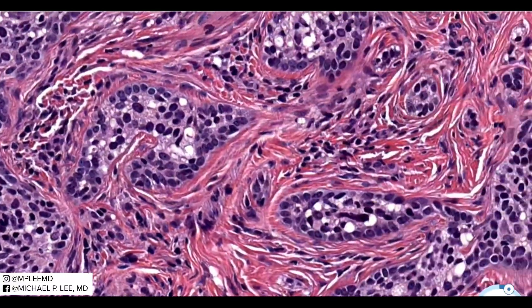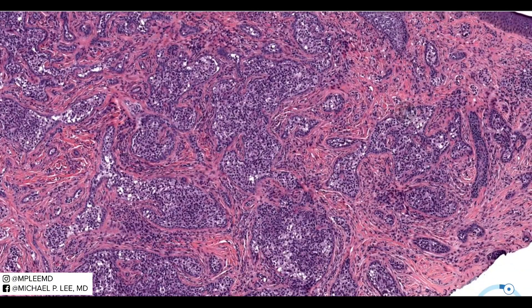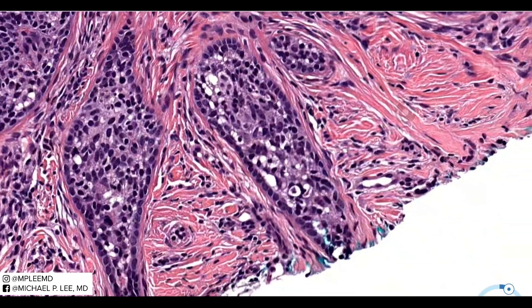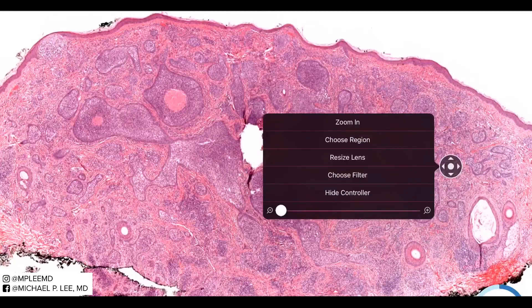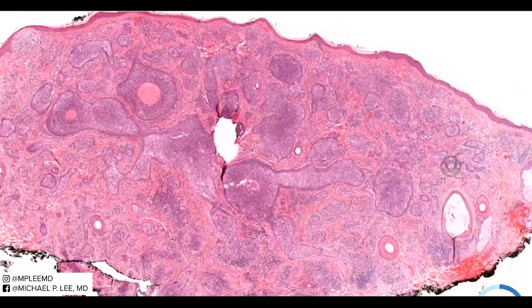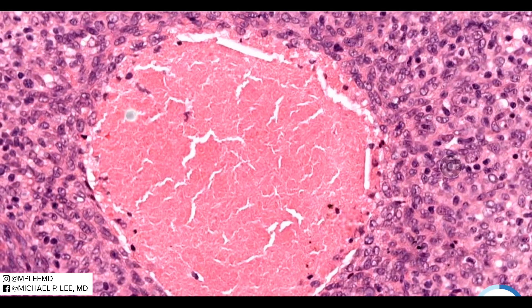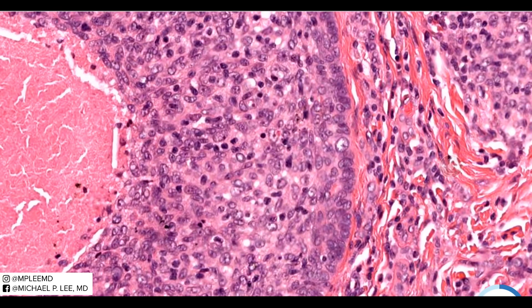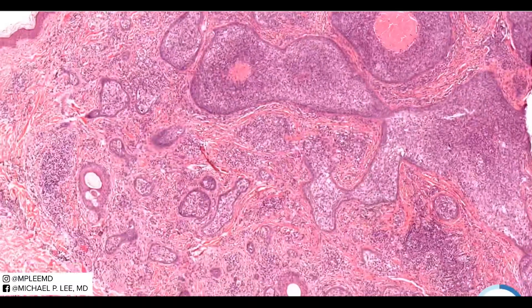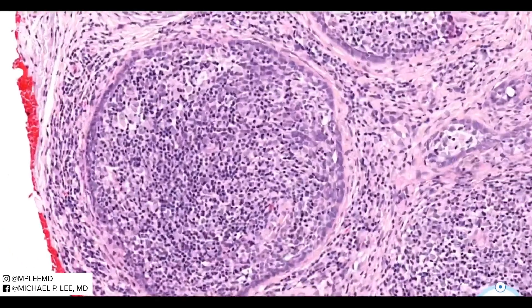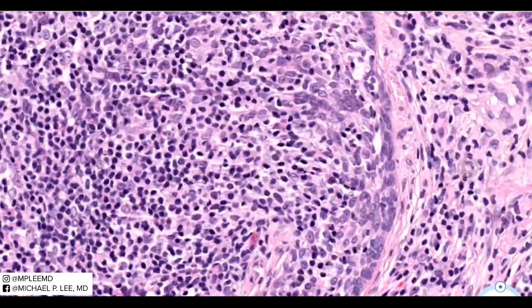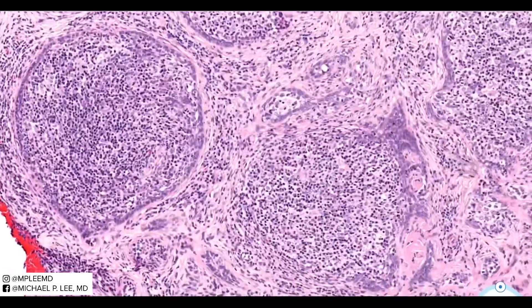Looking at more cases: this one has quite a bit more of an almost ductal differentiated appearance, but again CEA negative within those ductal islands. Here's another example from PathPresenter with quite a bit more clear cell differentiation, and even areas that look almost like comedonecrosis, but with clear vesicular nuclei, prominent nucleoli, spattering of T and B lymphocytes, no mitotic figures, and a basaloid rim embedded in fibrocollagenous stroma.